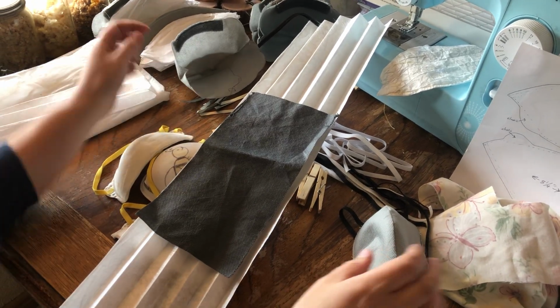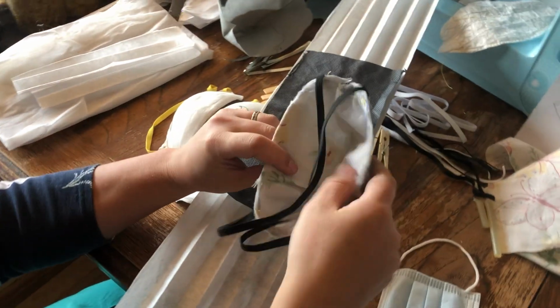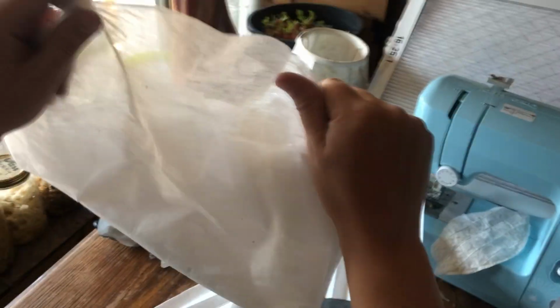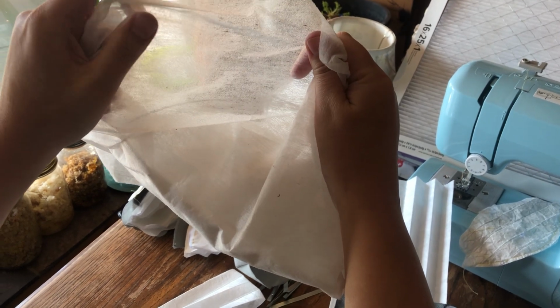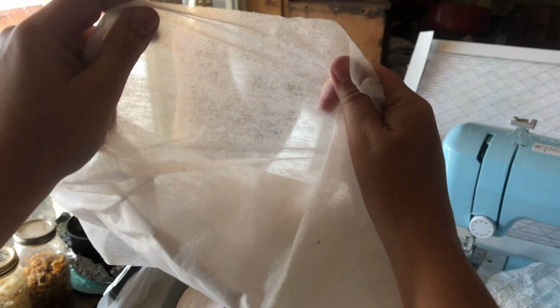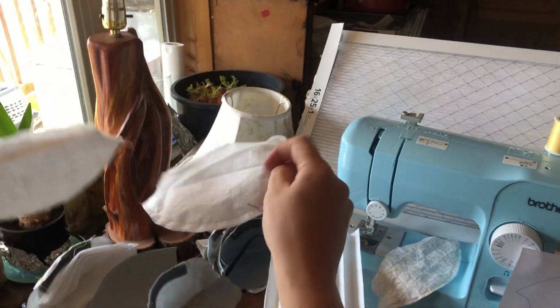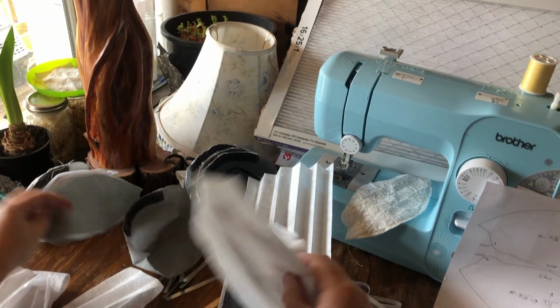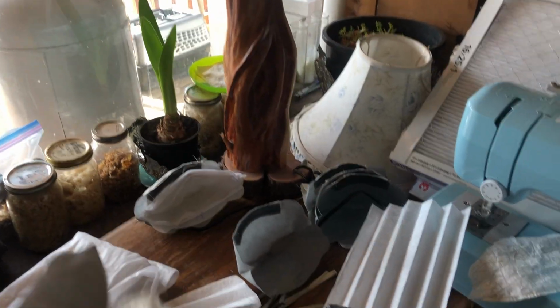Alright, so instead of putting my filter on the inside, I decided let's put the filter in the middle, the interfacing on the inside. I've got lightweight interfacing out of my sewing box, because this is what I have. Everyone will have something different. Make it, try it, and decide if you like it or not. So I'm doing 2 layers of my lightweight interfacing. That's this right here. 2 layers of interfacing, 2 layers of filter fabric, like that. 2 layers, and then 1 layer of the grocery bag, or stiff interfacing, whatever you got. Okay, so those are my pieces.